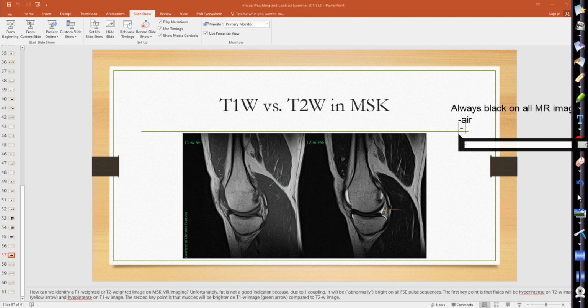Non-ferrous materials. Okay. And yes, something with no MR signal. Good. We could talk about all the different devices that we could bring in. Yes, a tissue with no hydrogen spins in it. But let's talk about just the makeup of our body.